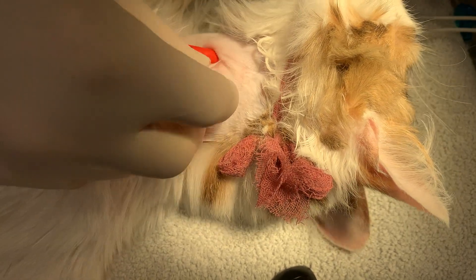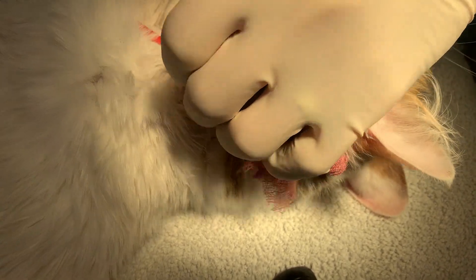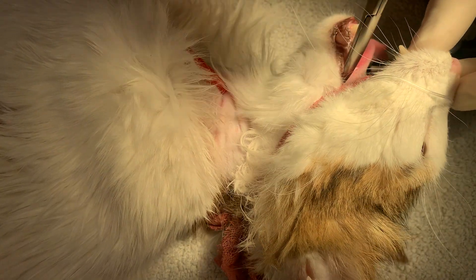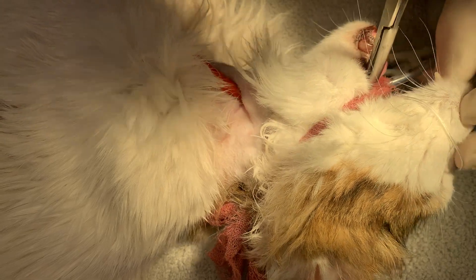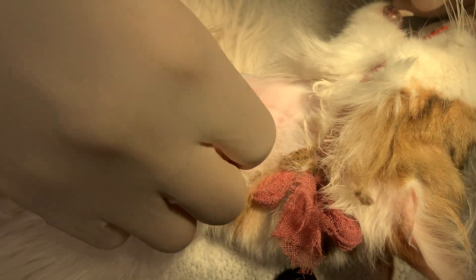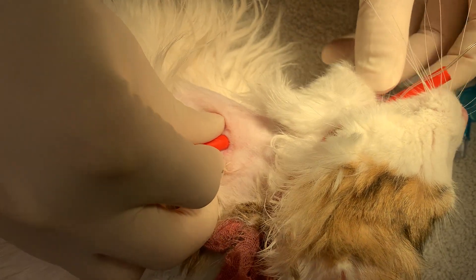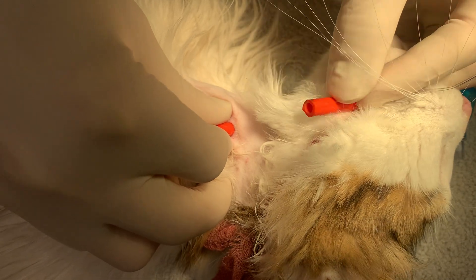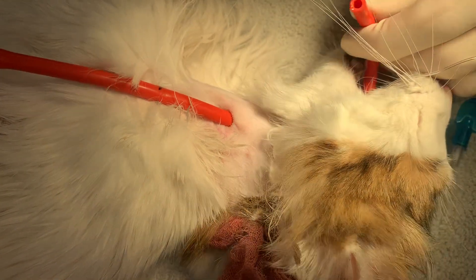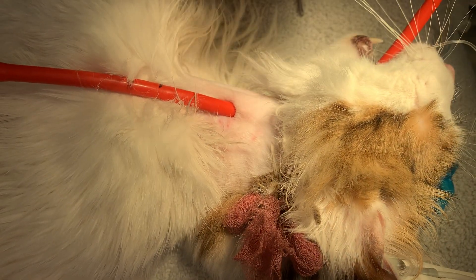Once it's through, we're going to take it and turn it around on itself — I'm doing it outside the mouth so you can see — turn it around on itself and push it back down into the esophagus to point it the other direction. Grasping it with forceps helps to do that, and lubricating it helps a lot too. As you're passing it down, pulling it out a little bit to relieve the kink helps. Once you feel it kind of flip and slip, you can feel it down there, then we can advance it.